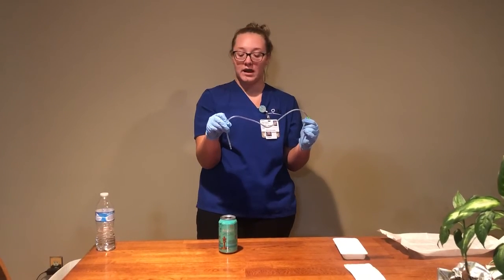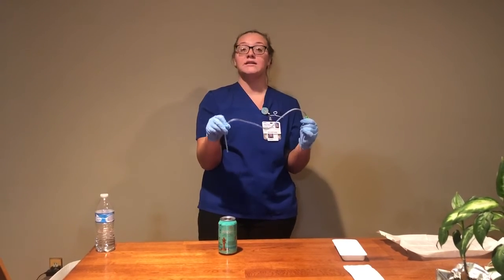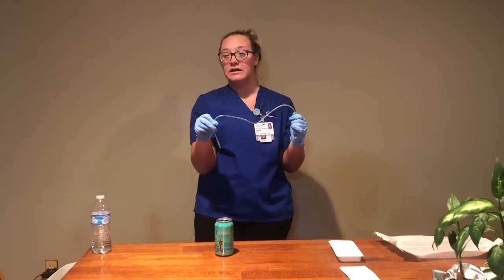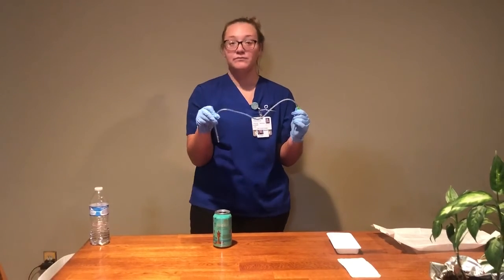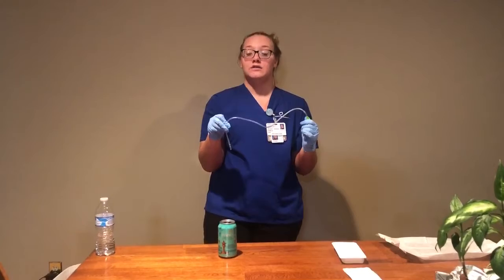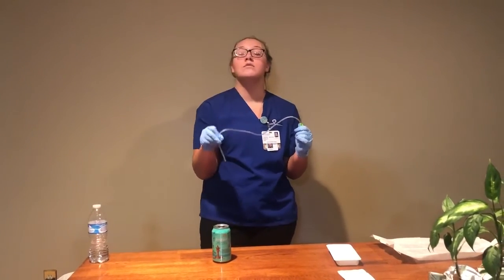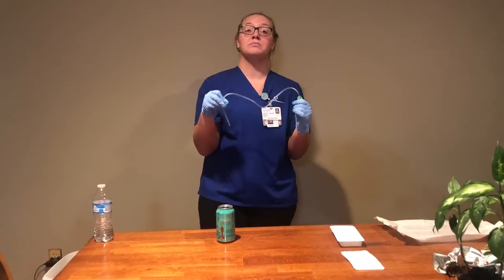And after that, I would flush my catheter, and then I would assess the effectiveness of the suctioning, and I would repeat if needed. And then if I remain sterility, I can just redo it again. And then I would also make sure that my patient would be able to tolerate it again if I was to do it again. And then so if I was to do it again, I would make sure I would do a 30-second to 1-minute interval to allow my patient to take a couple deep breaths so they can breathe again.